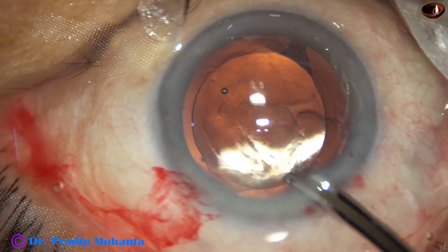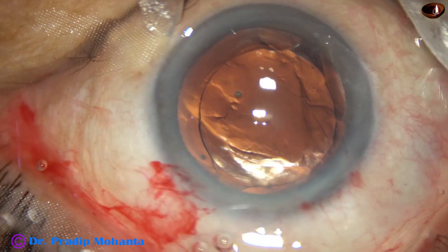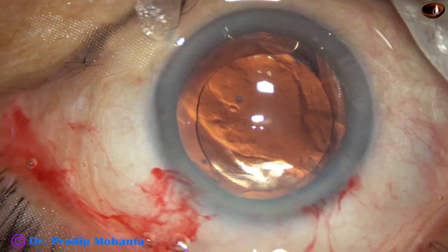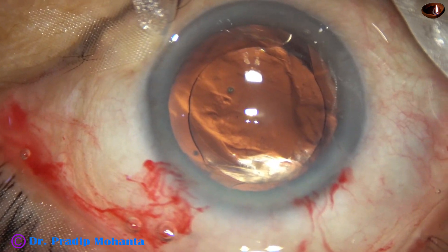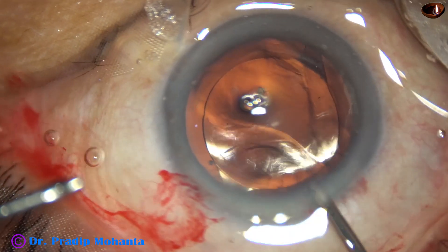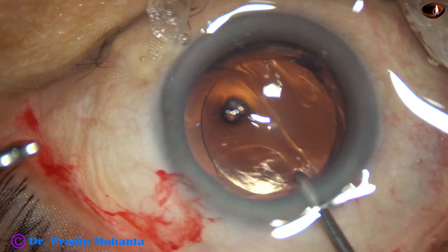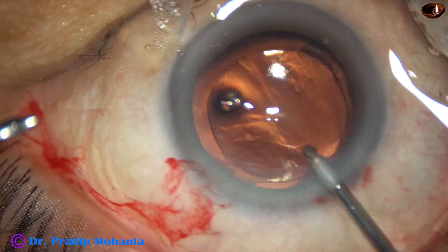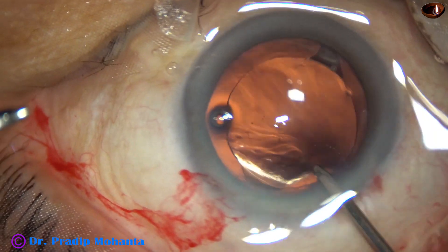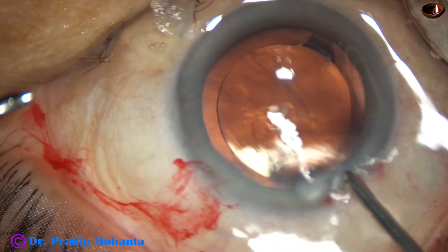My plan is to remove the visco nicely, but I do not want to go behind the lens, because if I go behind the lens the vitreous may get hydrated and may prolapse into the anterior chamber. I am using the irrigating probe of bimanual IA, irrigating out most of the visco that was there in the anterior chamber.